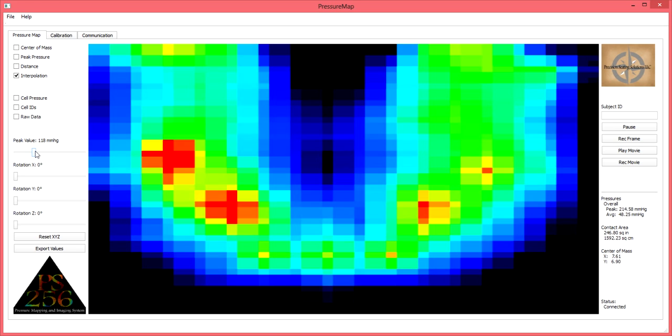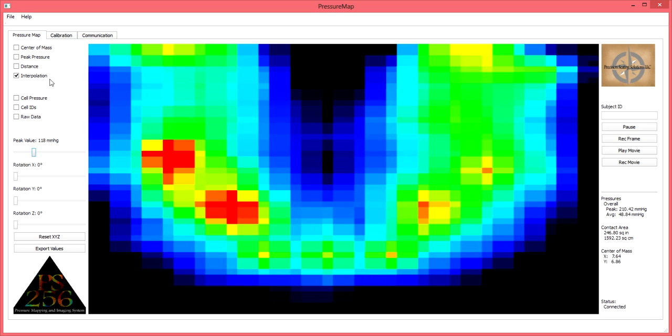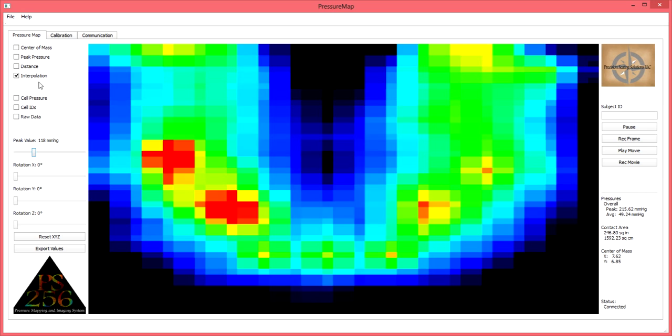First, it is important to ensure the interpolation feature is selected. This feature will provide the user with the most ideal color blend, resulting in the best image.